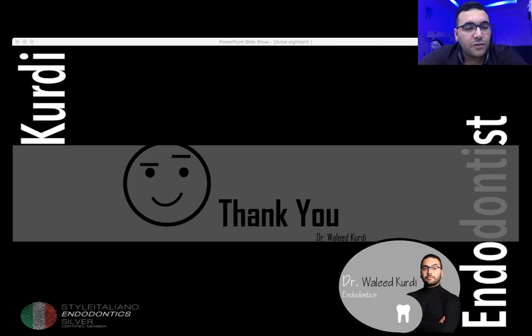What is the best fluid to be inside the canal during retrieval? For me, it's EDTA solution indeed. Not during the retrieval, but after the file is loose, to remove the file, it will be EDTA solution to help the file or the separated instrument to be flushed outside the canal. But during that refining or during the retrieval technique, I use sodium hypochlorite only.